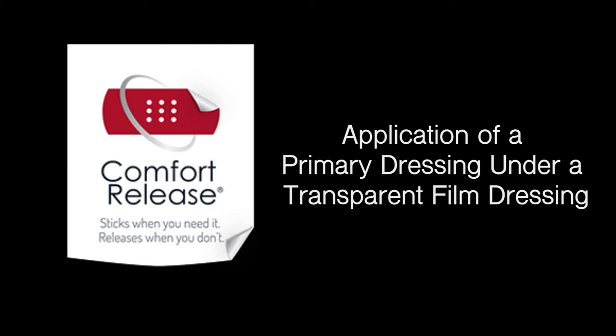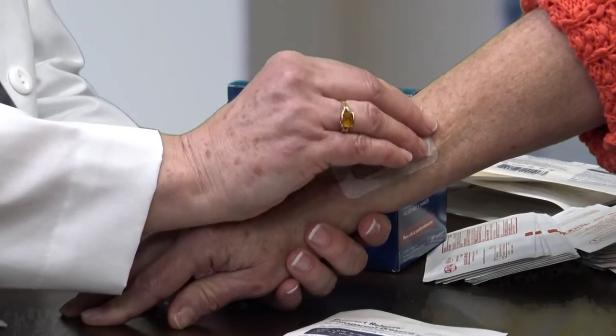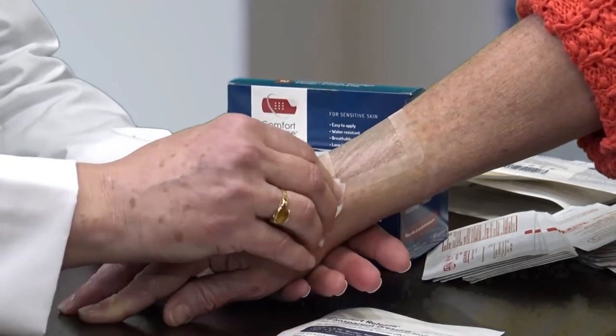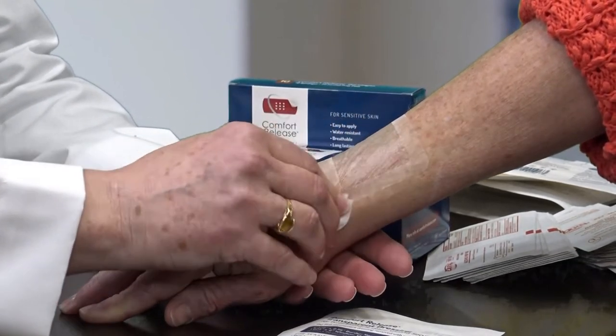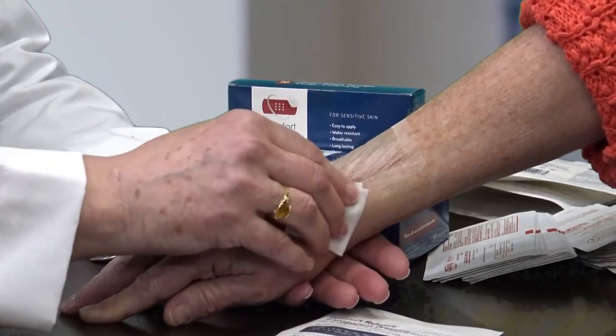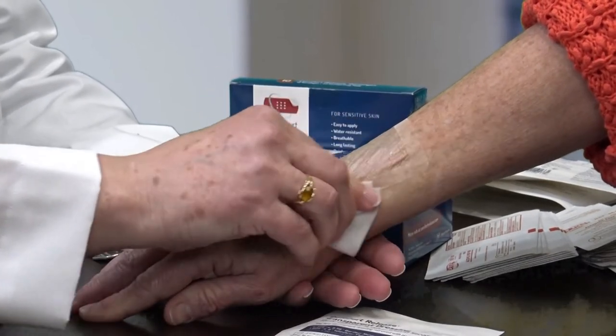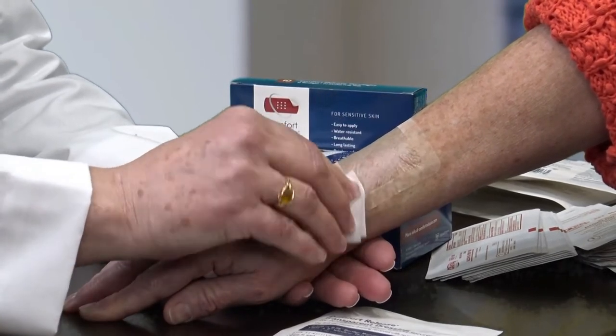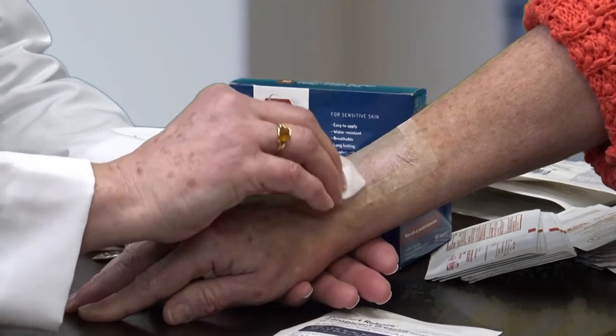I am now going to demonstrate application of a primary dressing under a transparent film dressing. We are going to loosen or switch off the border of the transparent film dressing that is already in place, with the rationale that this patient perhaps has a little oozing of their skin that is too much for the transparent film dressing to manage.